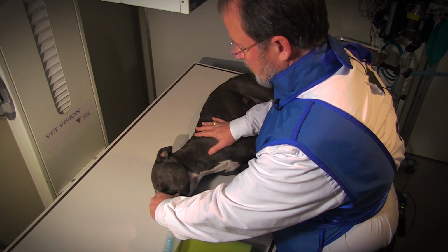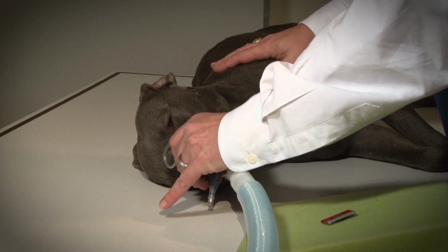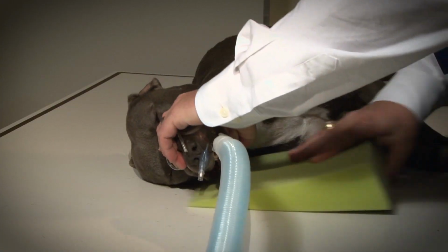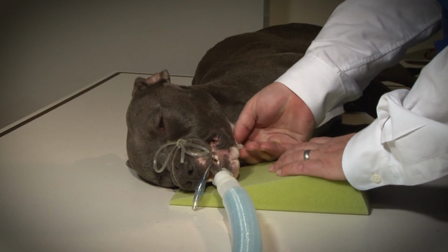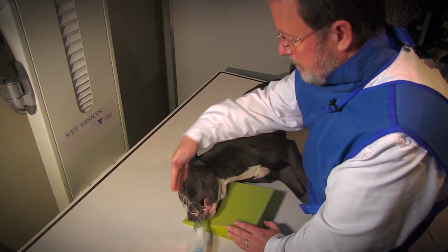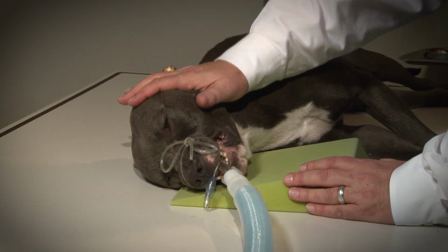One is manually, you can grab their nose and actually rotate it up like this to where their skull is straight. But for radiation safety purposes, that's not ideal. So the best way to do it is to grab a foam wedge, such as this, which is radiolucent, so you won't see it, and you can stick it right underneath here, underneath the mandible and underneath this part of the neck, and that will elevate that part of the mandible up, and his eyes are going to be nice and straight and perpendicular. Now we have a nice straight film, straightly positioned dog, which is what we want.